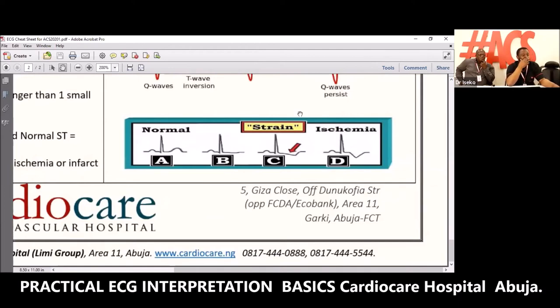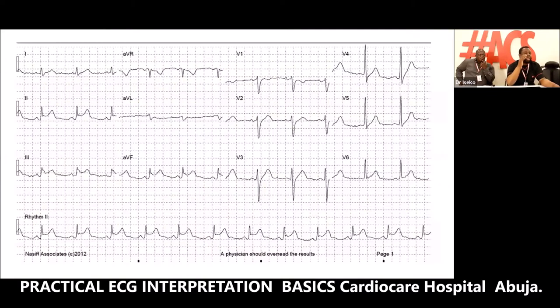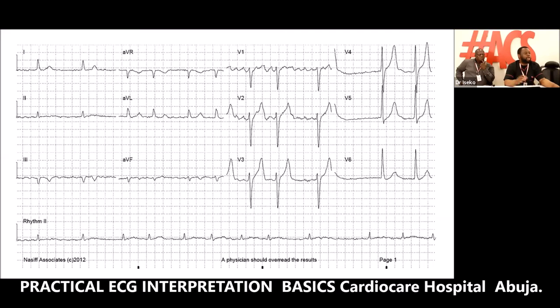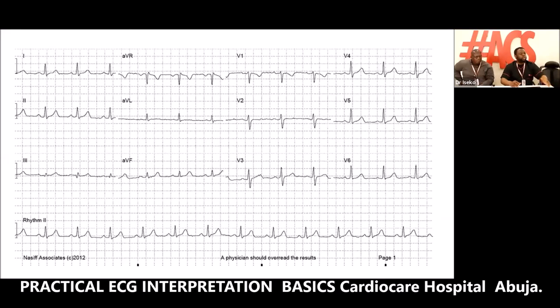Let's go to the cases and let's start using our cheat sheet. Now remember, you already have written it down, so let's start answering. So next slide, we'll use this one just now. Next slide. Okay, great. So the first question we said is, what is the rhythm? Yes, what is the rhythm?